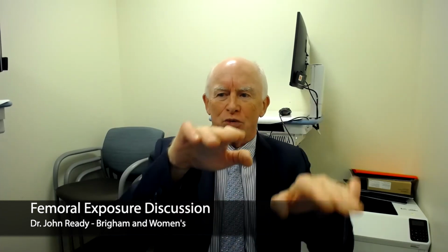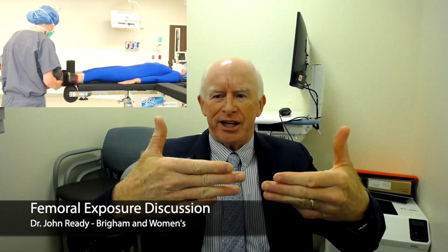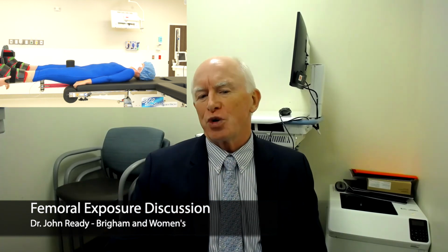One of the reasons it didn't pop up with the Hana is because you've got the body sitting on that little triangular pad, and the pelvis tends to rotate. Whereas with the arch, you're on a regular OR table and it's sitting very square at the end. So when we drop the leg, the end of the table almost is a bit of a fulcrum to help pop that femur up and get a good look at it.